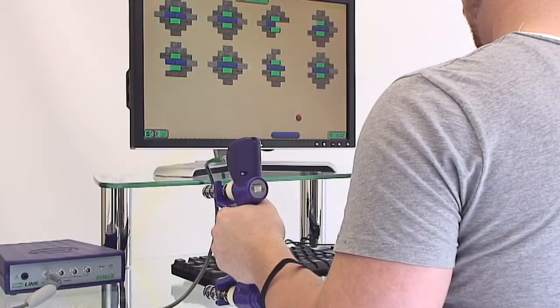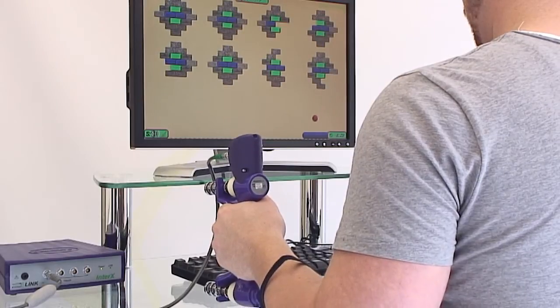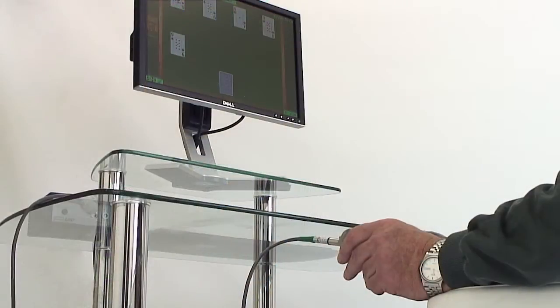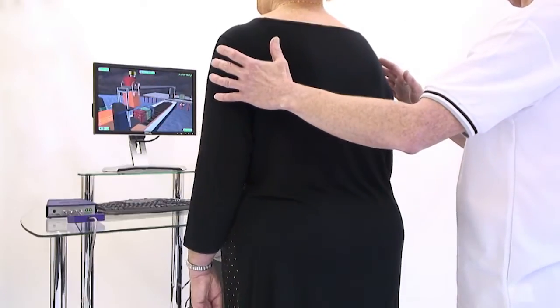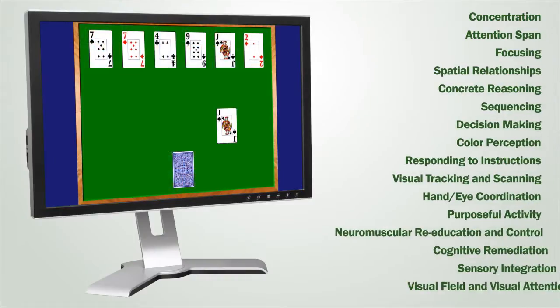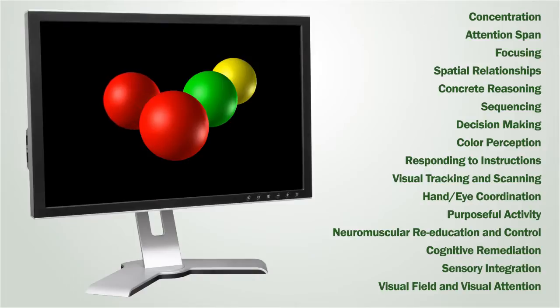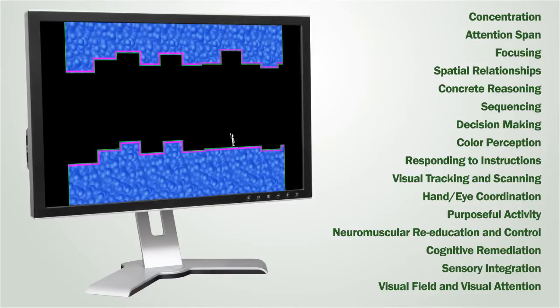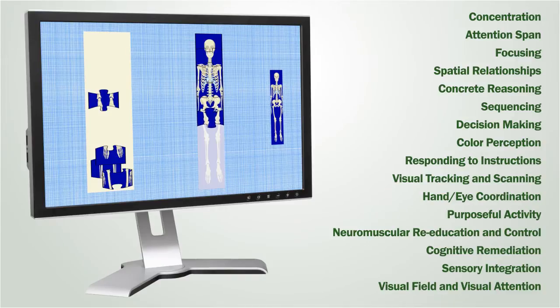Various E-link sensors and computer-based activities provide gradable, functional exercise throughout the full rehabilitation process. Muscle strengthening and restoration of normal movement patterns are encouraged for both the upper and lower extremities. The activities also provide a fun element to the therapy session, which maximizes the patient's motivation to exercise, and some games have been specifically designed to help address cognitive and perceptual issues.